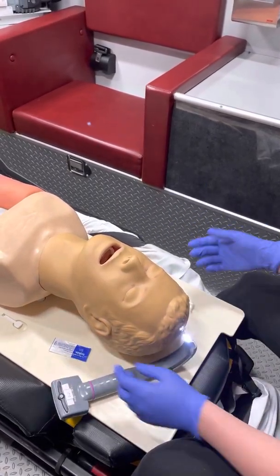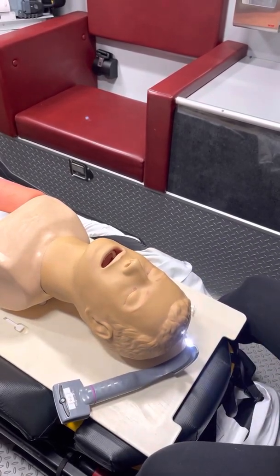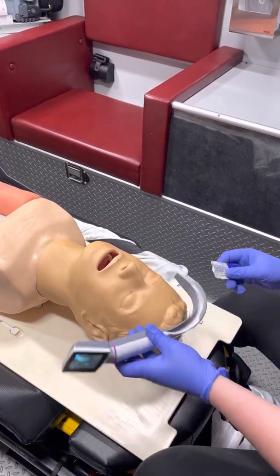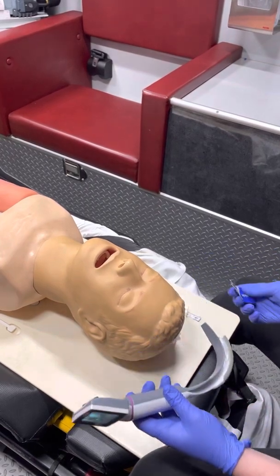Obviously you'll have someone bagging your patient right now, hopefully with some kind of airway adjunct. For your lubricant, a lot of times when I'm using the King Vision I just go ahead and put it right in the track, but you can also just put it on the side of the tube.